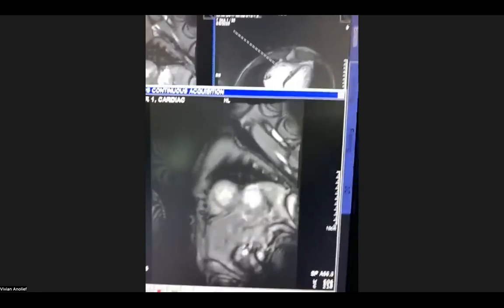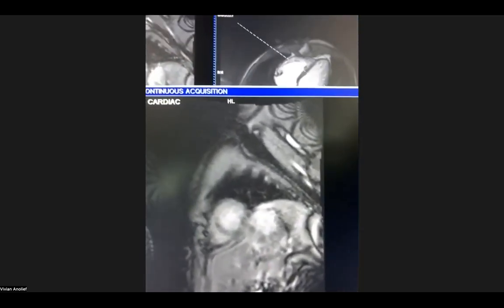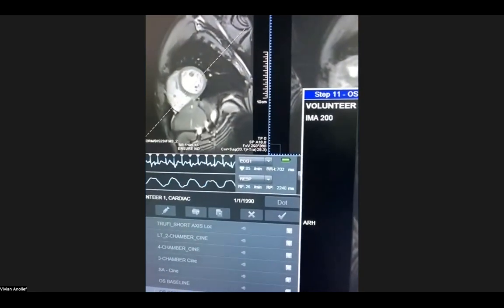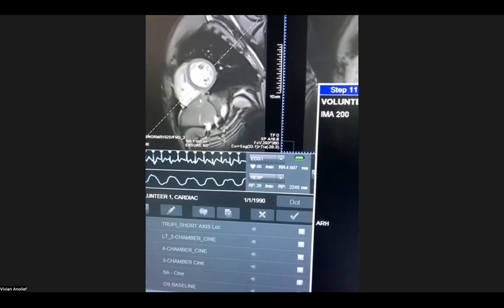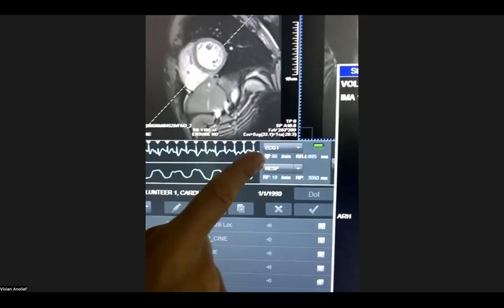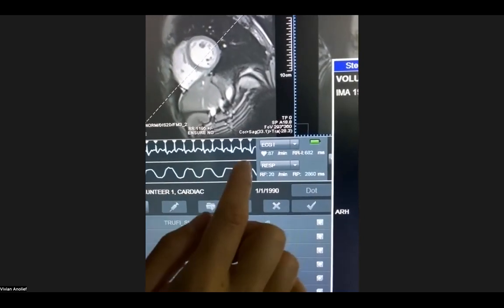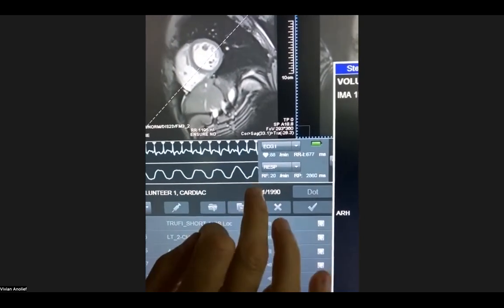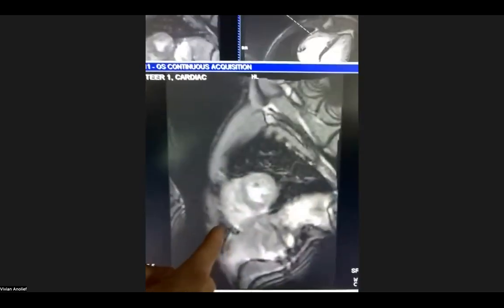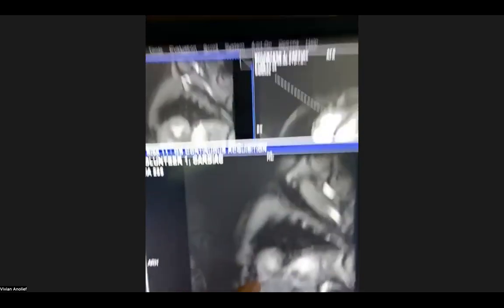Start breathing with the beeps. So here we go, the hyperventilation. Again, cues to look for are to watch the patient in the scanner, which you can't see, breathing up and down. His chest should be moving through this. The heart rate should go up, so you can see the heart rate is rising. These peaks should become well defined, up, down, and the respiratory frequency should go up to 30. And finally, another check you have is the image quality. The image quality should get really bad, and you can see that it's really bad.